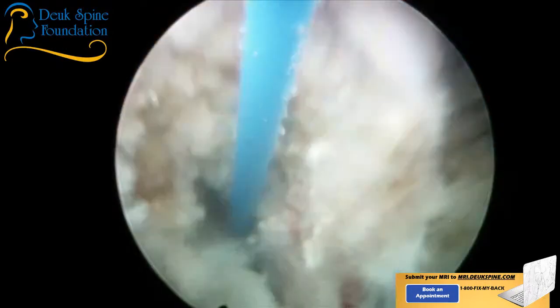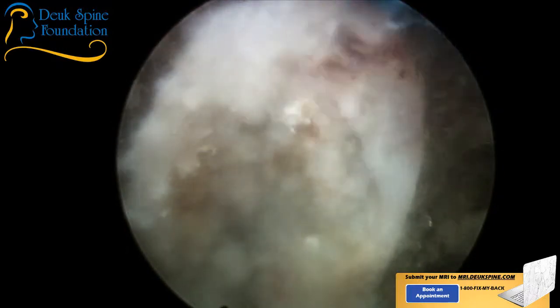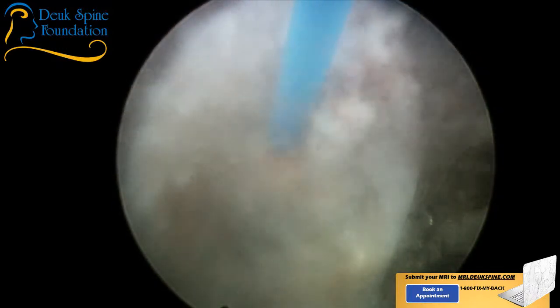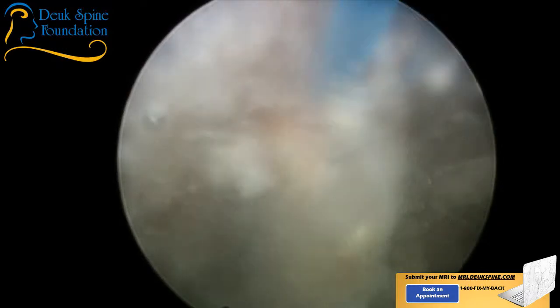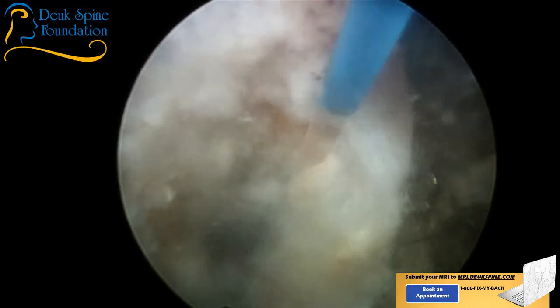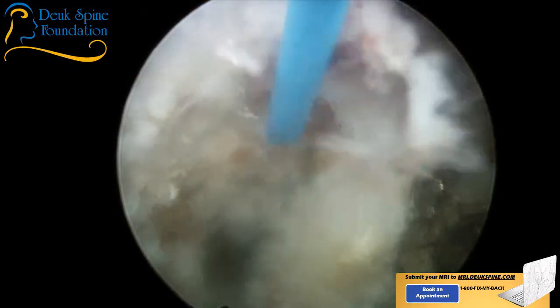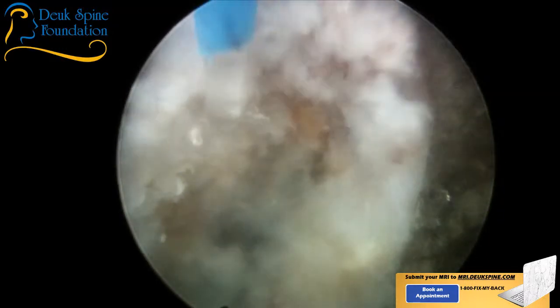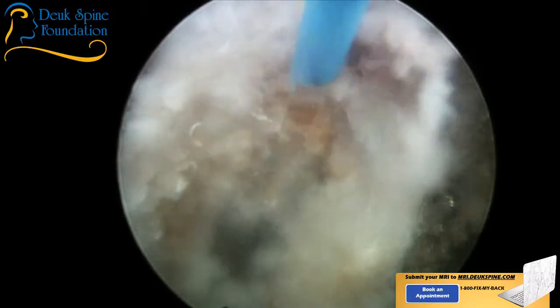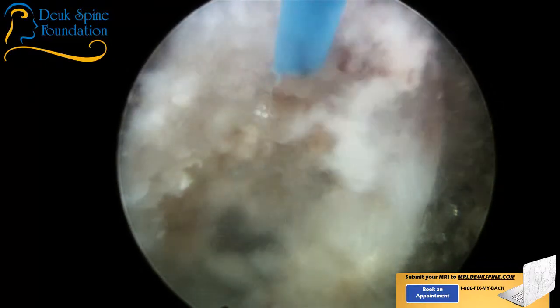Okay, so let's see if I can target that medial component a little bit better. We didn't get a great discogram on this because of all the scar tissue. But what I'm zapping right now is the part of the disc that's causing the pain. 2 minutes, we're done. 2 minutes.